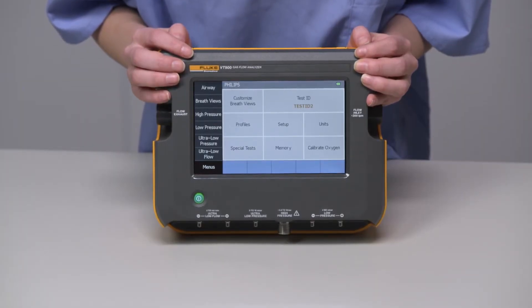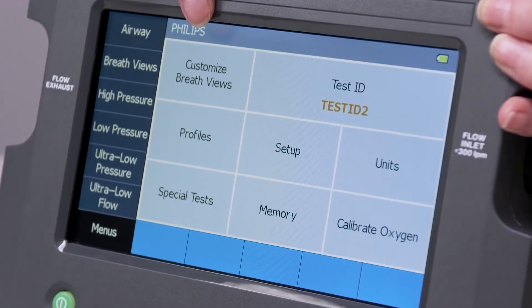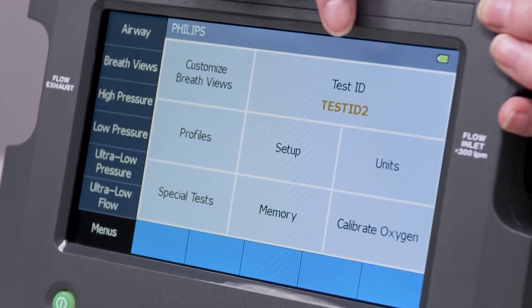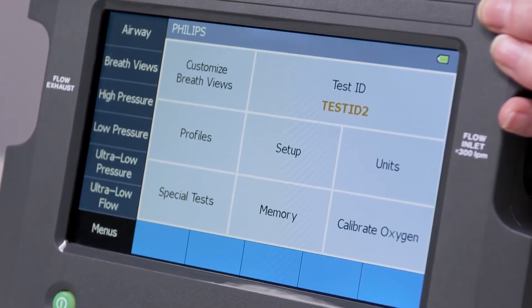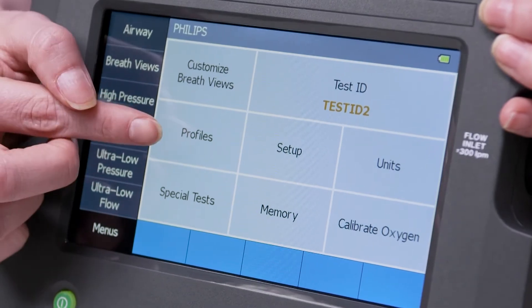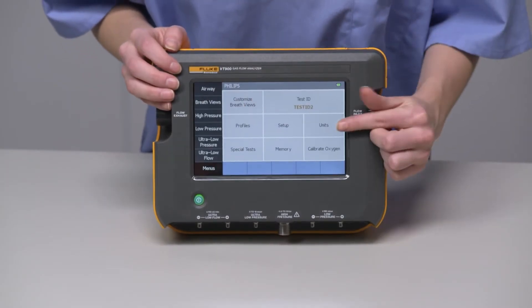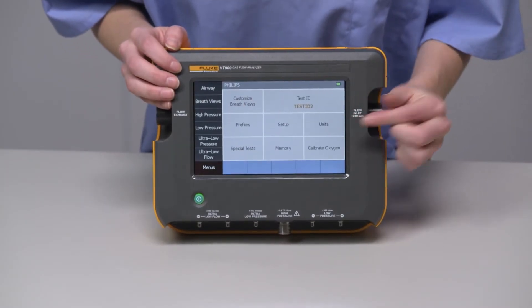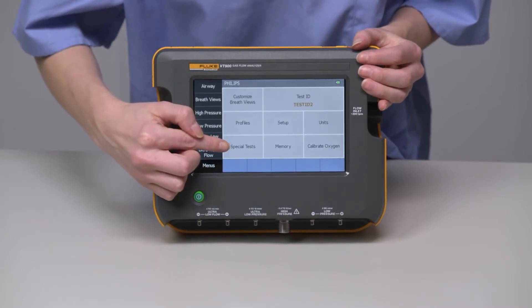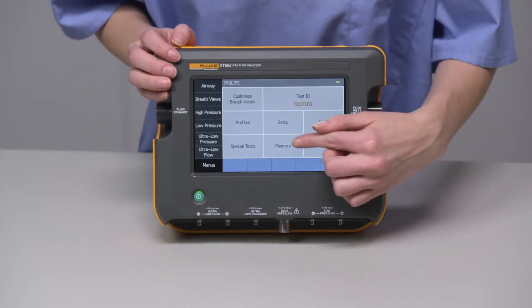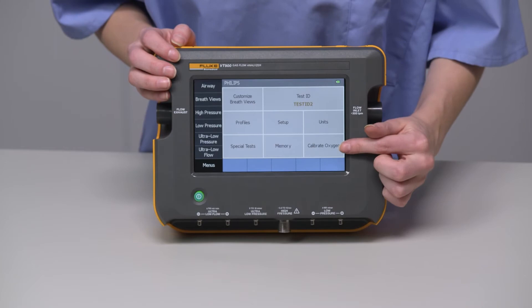Here is where you set up your device for testing and configure your testing preferences. On the Menus screen, you'll find the Customization of Breath Views option, your test IDs, your saved profiles, device setup, change units of measurement, perform special tests, see saved data, and calibrate the oxygen sensor.